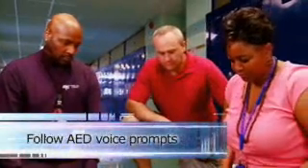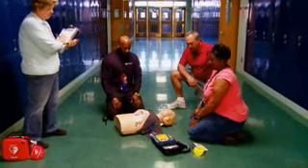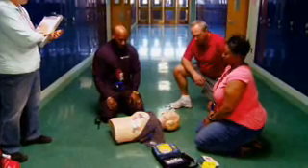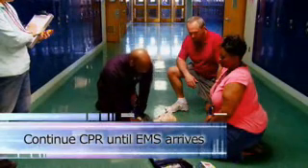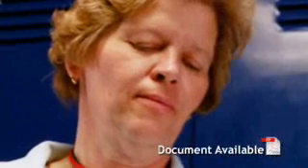No one should touch the patient. "Clear. Analyzing. Shock advised. Stay clear of patient. Press the flashing orange button now. Shock delivered." Once help is on the way, it is important to continue CPR with the AED connected until paramedics arrive. Remember, minutes matter in responding to a cardiac arrest.